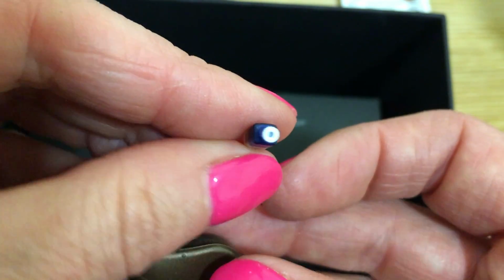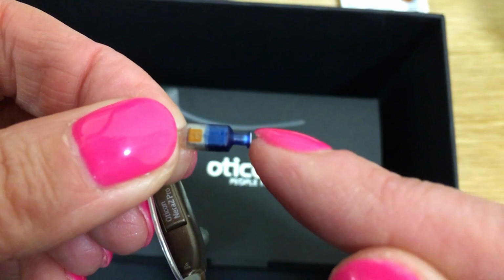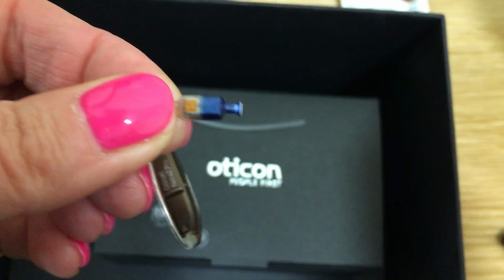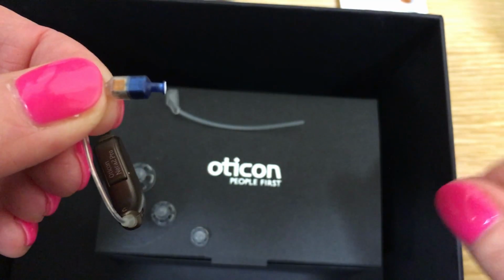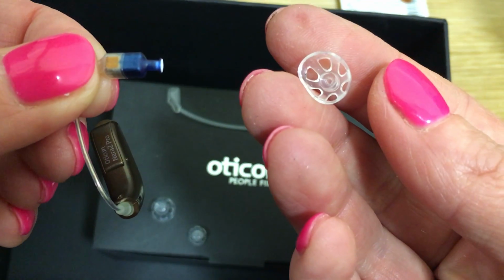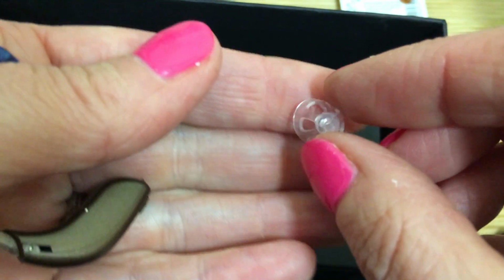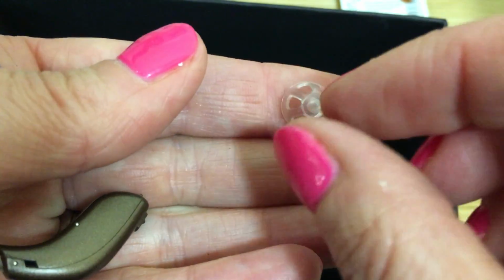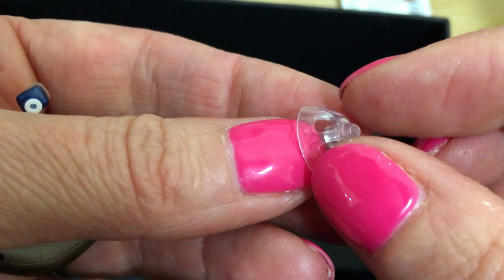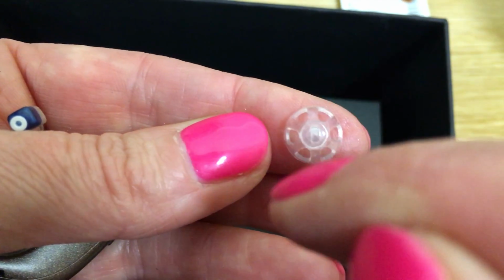We will now insert a dome on the end. When inserting a dome, it's very important that the dome is fully inserted across the end of the receiver to ensure that the dome does not come off in the ear. Here's the 10mm dome. The dome is comprised of medical grade silicone. This is an open dome, which means that sound can enter through the skirt of the dome.